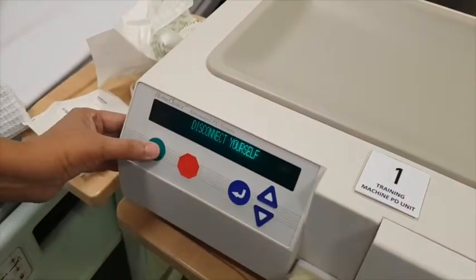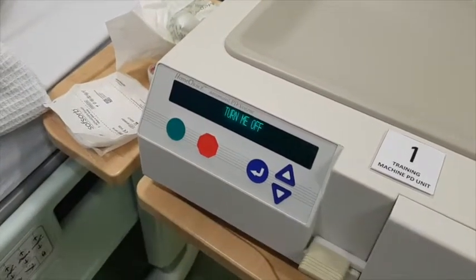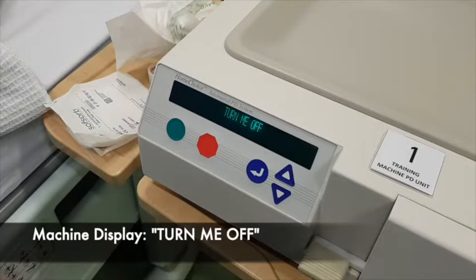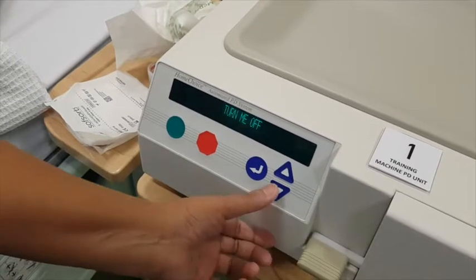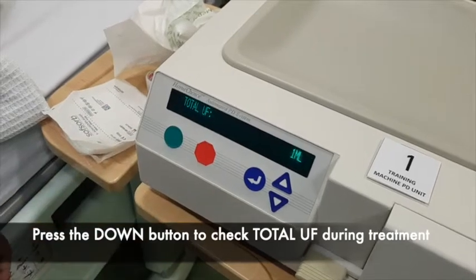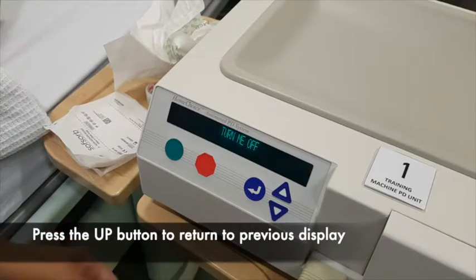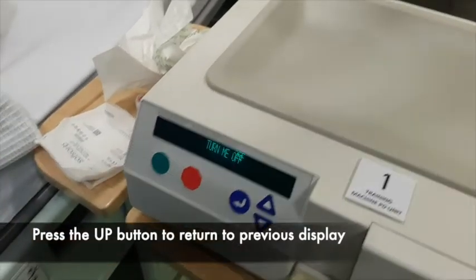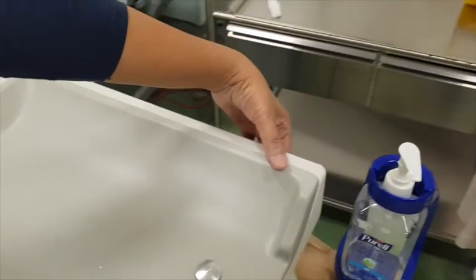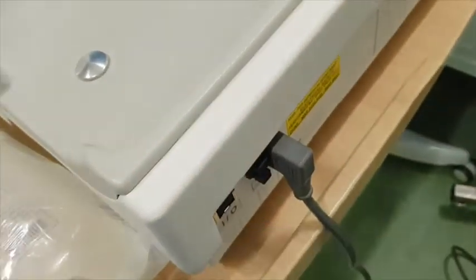After discarding your consumables, you can now press the green button. At this point, the machine will display Turn Me Off. If in case you need to check the total UF during the treatment, you can press the down button to display it on the screen. To proceed with turning off the machine, press the up arrow again to go back to the previous display. Then, you can proceed to turn off the machine by locating the switch at the back.